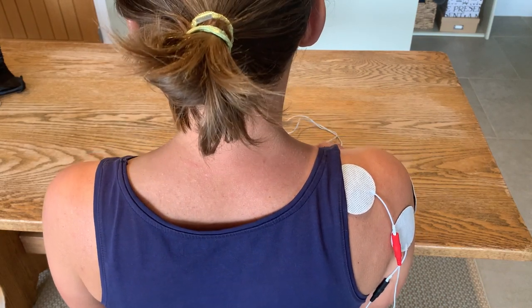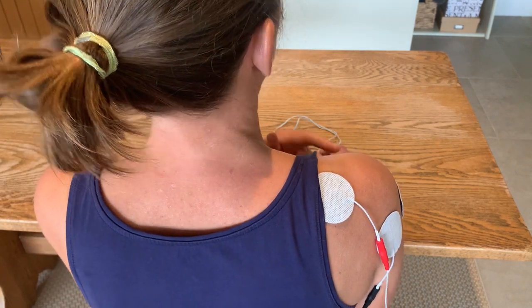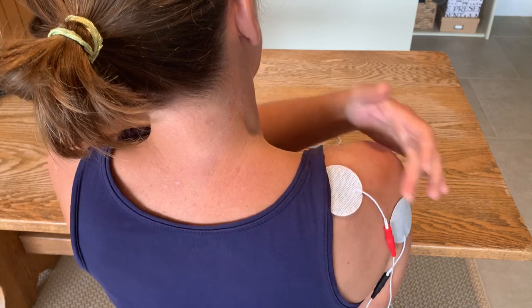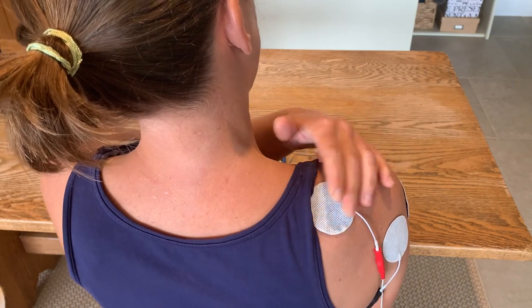Electrode placement for shoulder subluxation. I've got two channels, so two leads, which gives me four electrodes to place. I've got one on supraspinatus — run your finger up your shoulder blade, just as you come off onto the fleshy bit, that's where you place it.